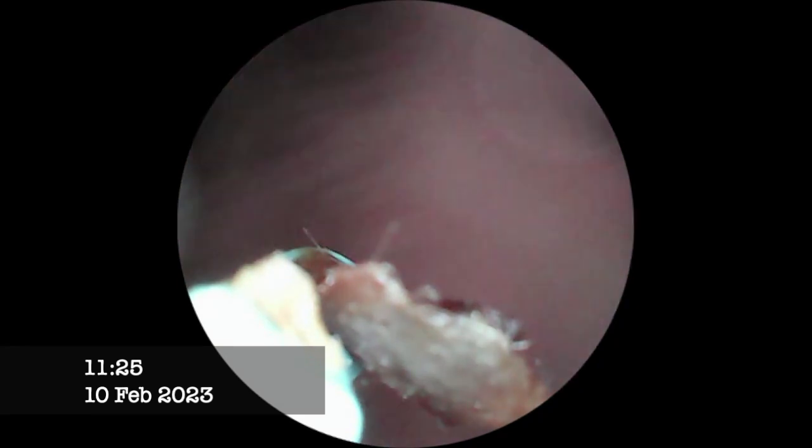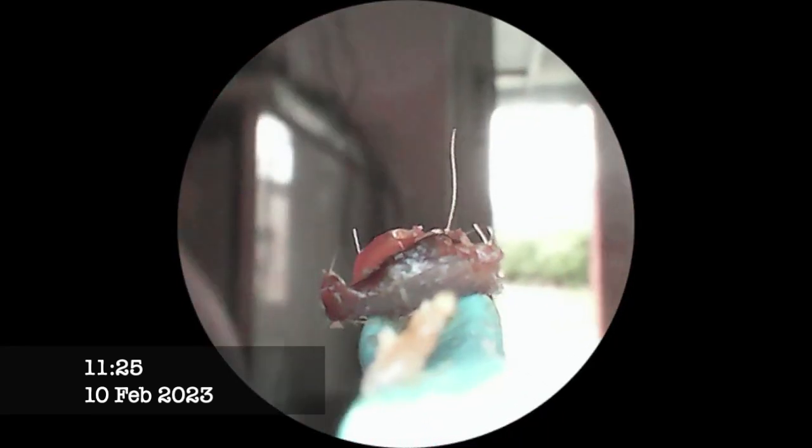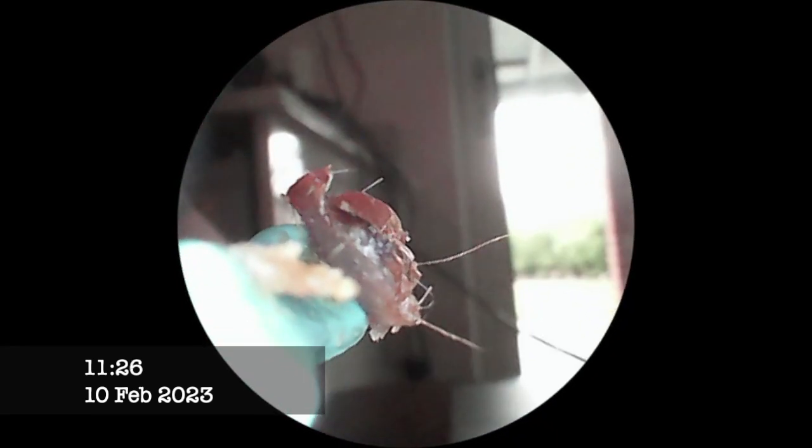You see, there were two main issues that we had with the video endoscope. Number one is that we couldn't actually see what we were doing, which kind of defeats the whole purpose of having a video endoscope. The end of it is too big. If it's too big, you can't actually get it inside of your ear canal, so you can maneuver the little wire tip on the end of it to try to get the earwax out. And you have no depth perception because it only has a single camera. You can't tell how far the earwax is inside of your ear if you can even see it at all.